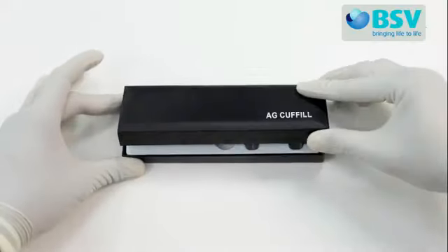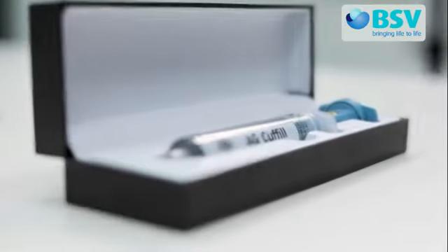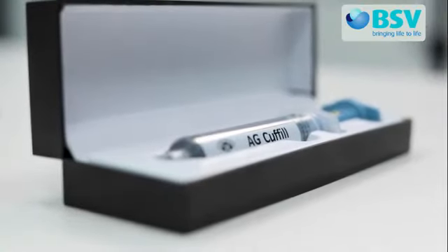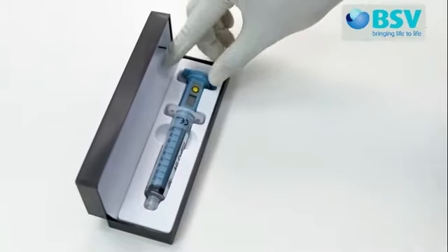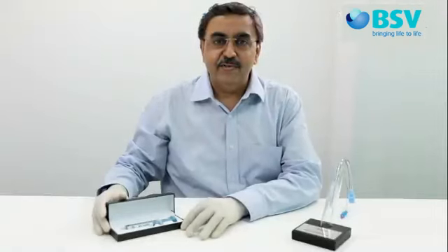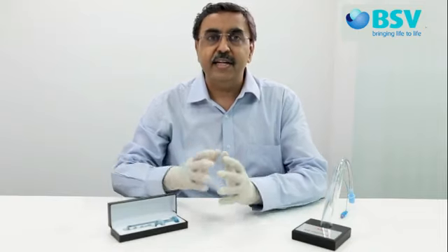We will show you how to use AG Cuffil and if required how to calibrate it. AG Cuffil is an innovative digital manometer which is CE certified, approved by FDA as well as DCGI. AG Cuffil is a very simple and easy to use device. Its unique syringe-like design makes AG Cuffil very useful and easy to inflate as well as measure the cuff pressure of endotracheal tubes, tracheotomy tubes and even LMAs very accurately.